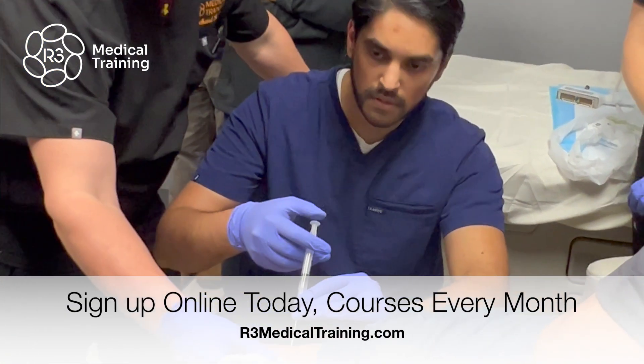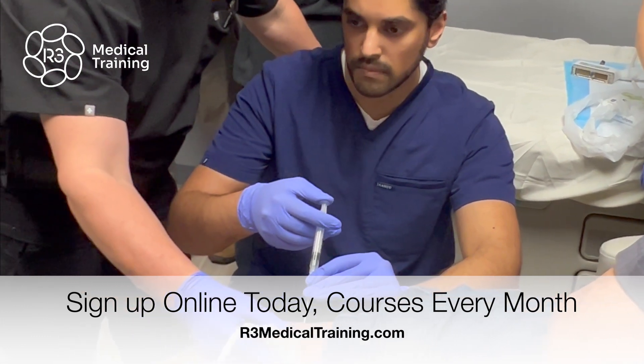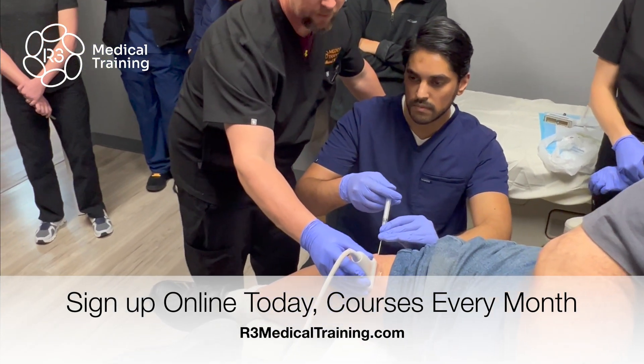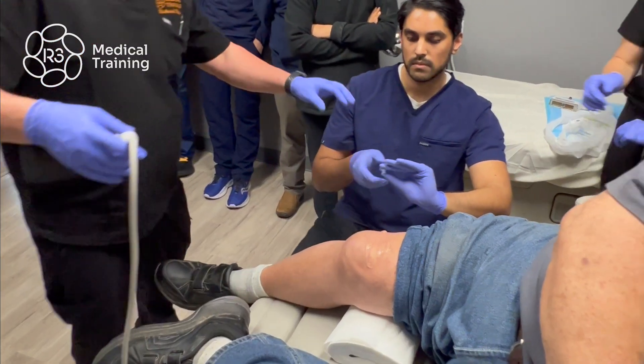Now I'm going to verify where your needle is. His needle is right there. Go ahead and inject all of it in there. There we go, and we're out.